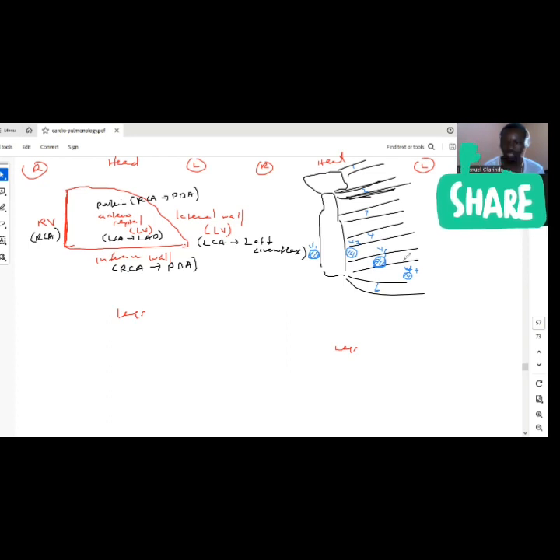And then if you keep going laterally, fifth intercostal space, at the anterior axillary line, you have your V5 lead, and then the mid-axillary line, all the way to the side here, still the fifth intercostal space, you have your V6. So you just place it like that. You start from the right parasternal border: V1, V2, V3, V4 at the mid-clavicular line, V5 at the anterior axillary line, and V6 at the mid-axillary line, right?